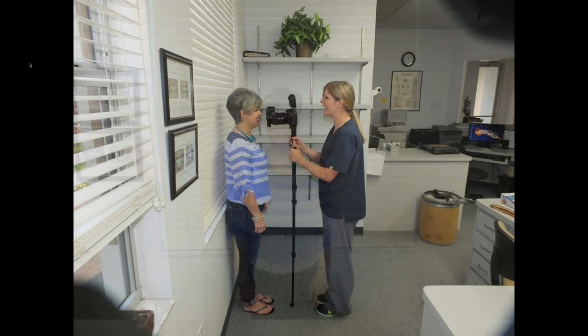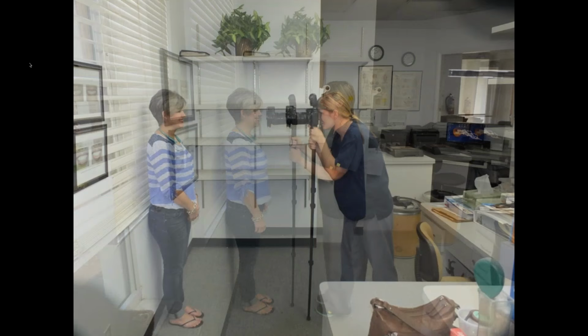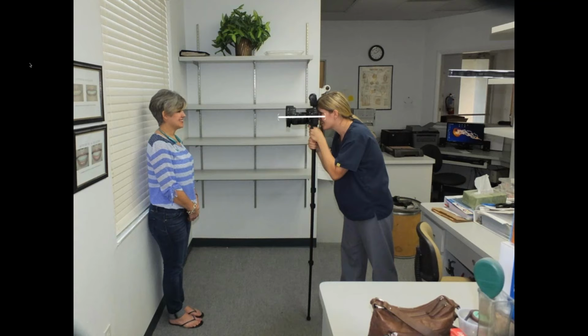But the key to this is to have a monopod on your camera. You move up to the patient, you set the foot of the monopod down so the camera is exactly at the same height as their maxillary incisal edge. That's where you set the camera, okay? Then you back up to take the photos. Now, when you look through, how do you know if you're leaning the camera forward or pulling it back a little bit? You can see she has the camera backwards just a little bit in this picture.